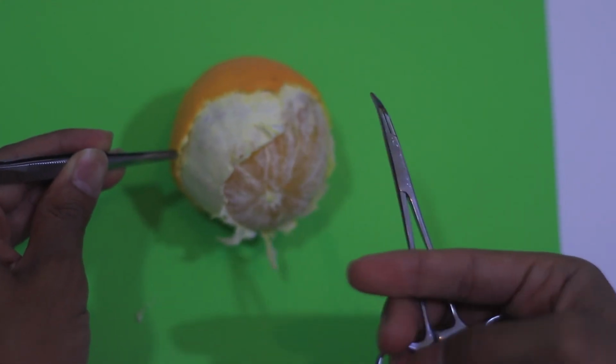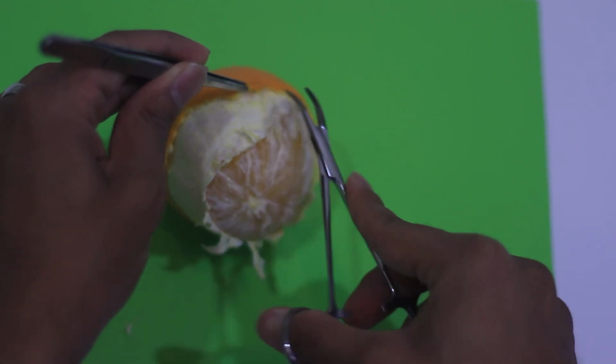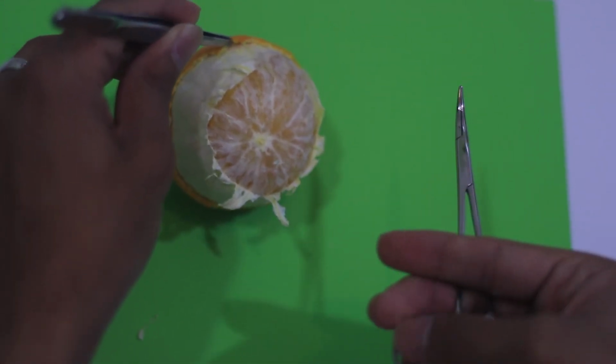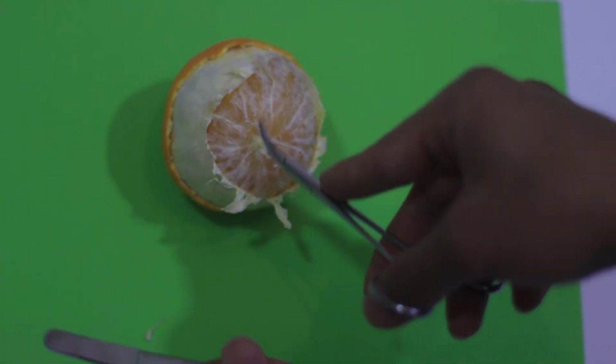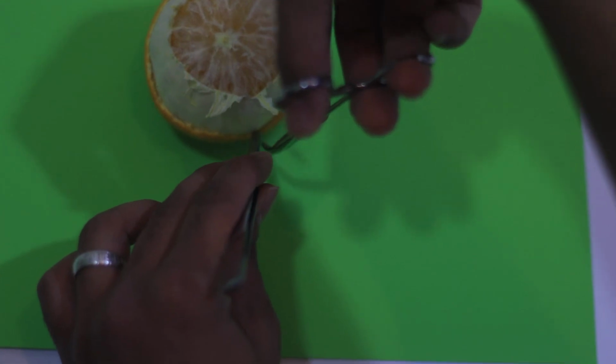Now what about if you want to do it from above? You can do it like this. Now from below, it's very difficult that you do it like this. You cannot do the dissection like this.